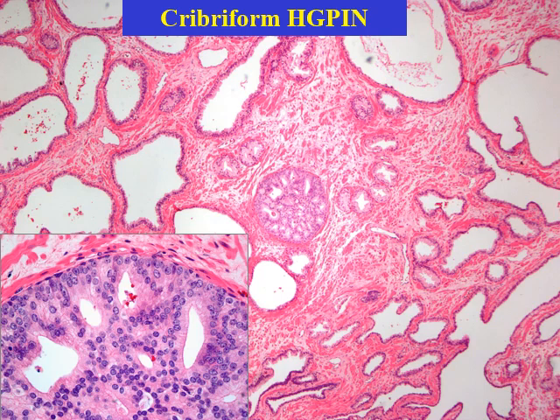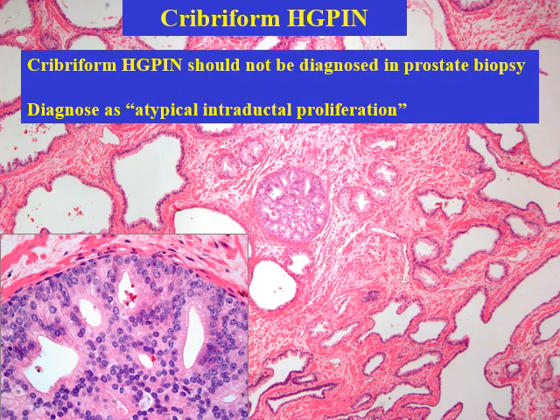This is an example of cribriform high-grade PIN in a radical prostatectomy specimen. You can see a single cribriform lesion with round and smooth contour. At high power, the nuclei are uniform and have small nucleoli. But I want to emphasize this: cribriform high-grade PIN should not be diagnosed in a prostate biopsy. Instead, if you see a cribriform atypical cribriform lesion in the prostate biopsy, it should be diagnosed as atypical intraductal proliferation for proper patient management, because these patients often need immediate repeat prostate biopsy.